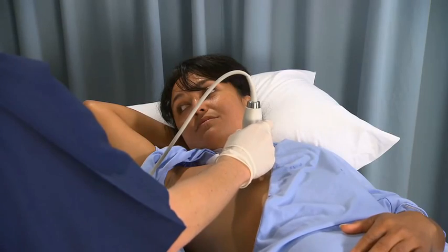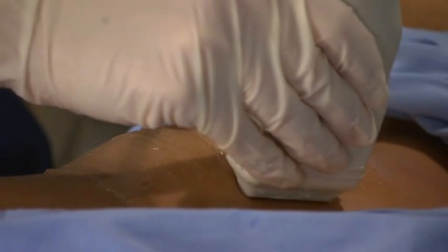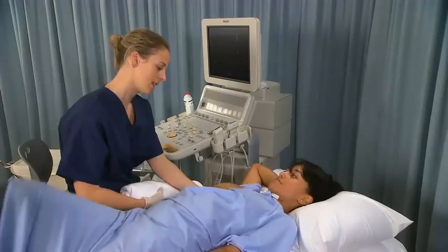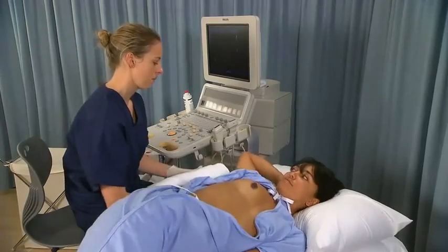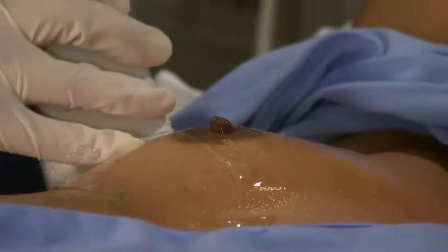Scan the inner aspect of the breast or medial quadrants in the supine position with the ipsilateral arm raised above the head to maximize the image quality. Roll the patient into the supine oblique position to scan the outer aspect of the breast or the lateral quadrants.